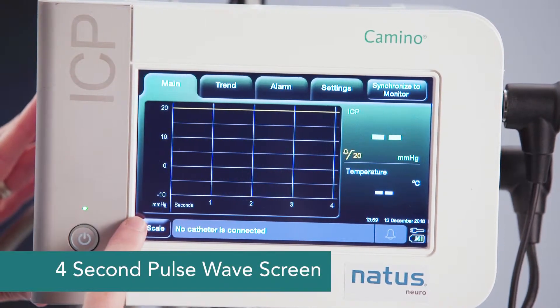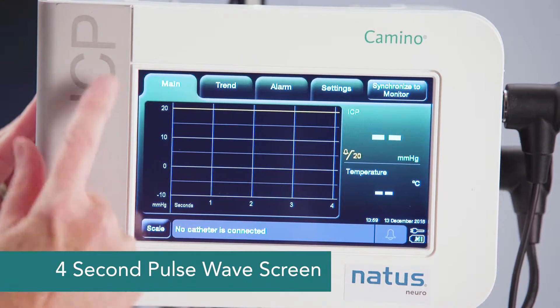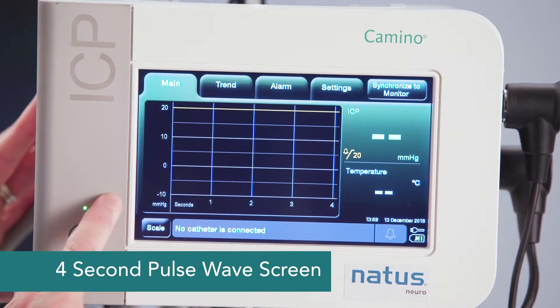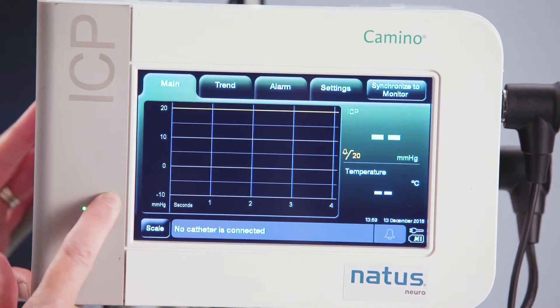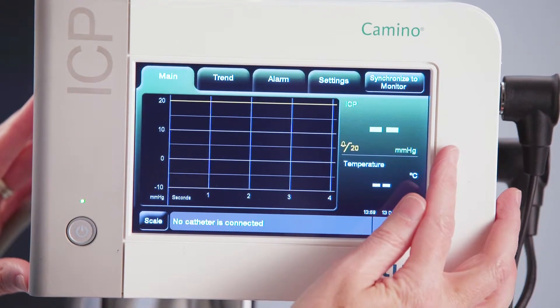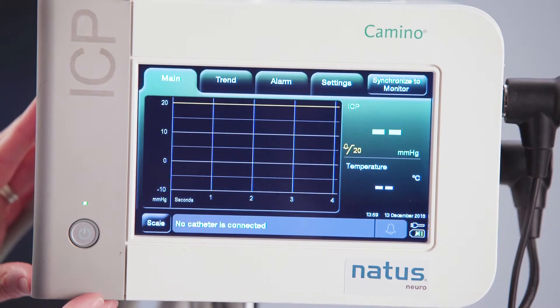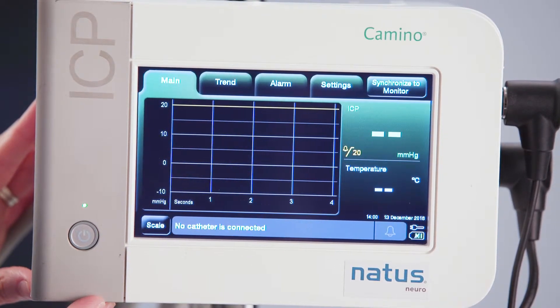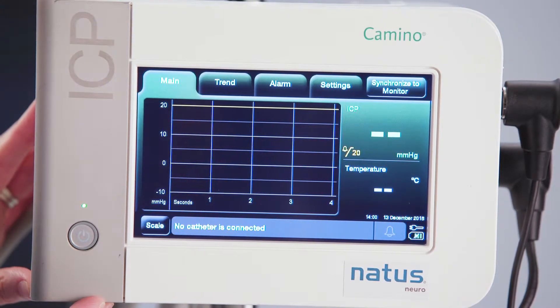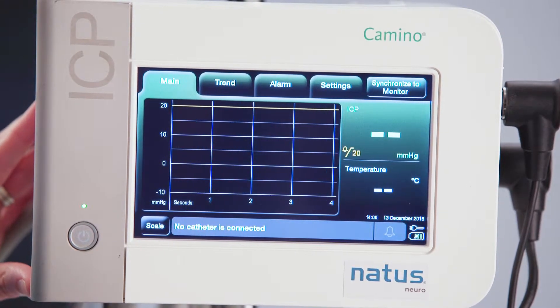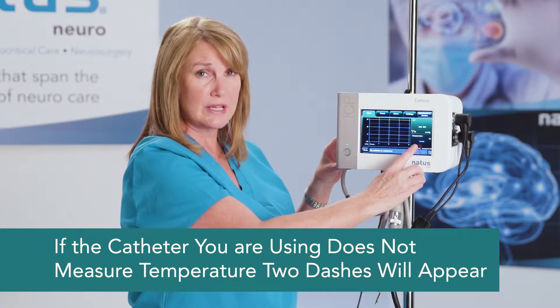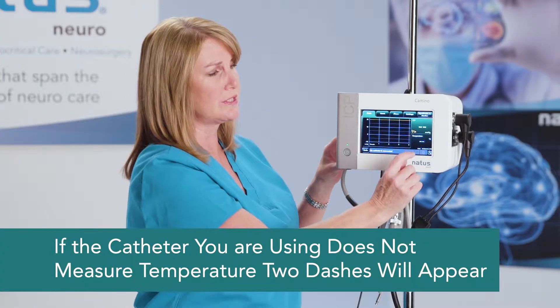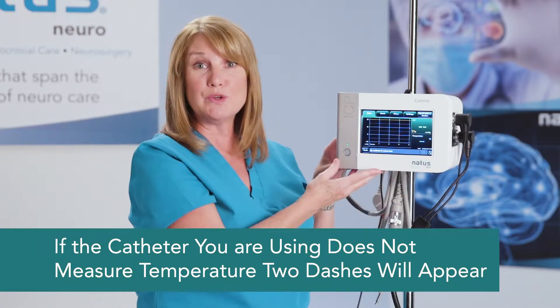You can see there's a four-second pulse wave screen here. This is where you'll be able to see compliance of the brain by watching your P1, P2, and P3. Up in the top right corner is where your ICP value is displayed in millimeters of mercury. If you're using a Kamino catheter that allows for temperature monitoring, that will show below in the temperature area. If you do not use a catheter that allows for temperature, you will see two dashes, and that will be normal.